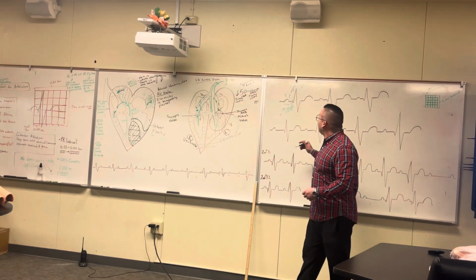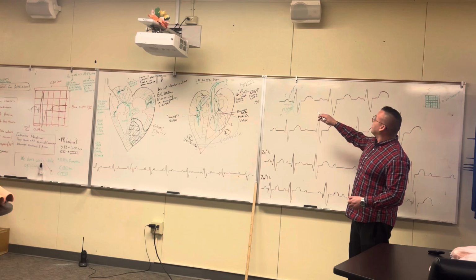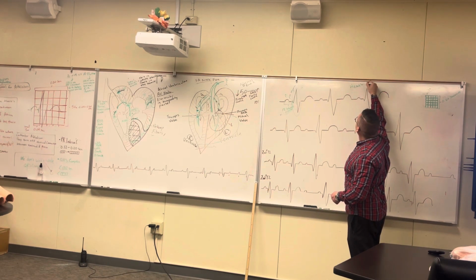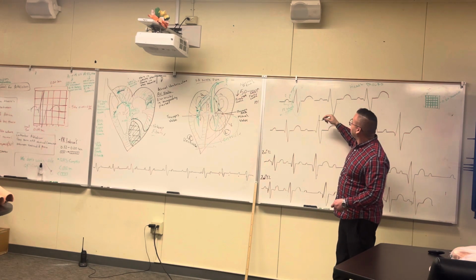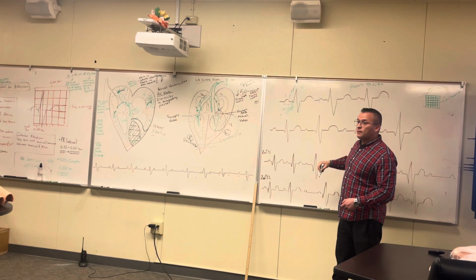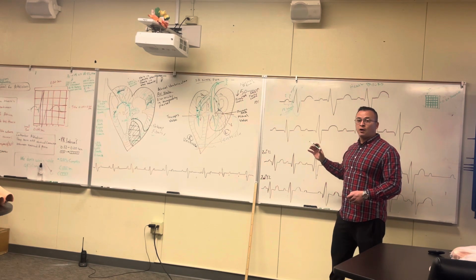Okay, so let's reiterate. What we care about right now, we're gonna talk about heart blocks. With heart blocks, our main focus is between the beginning of the P wave and the beginning of the QRS. That's the focus for heart blocks, okay?